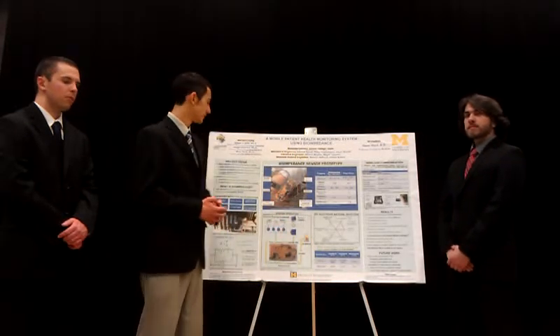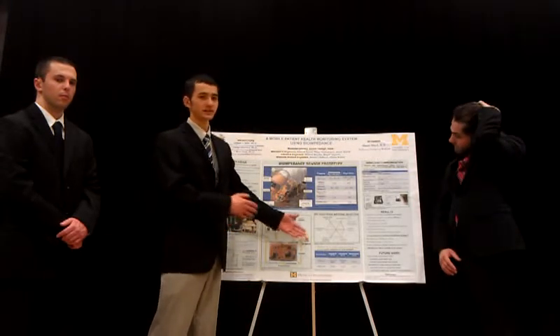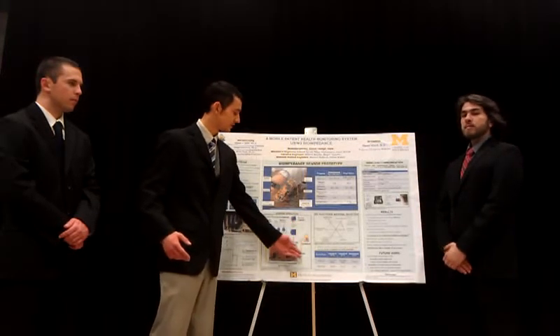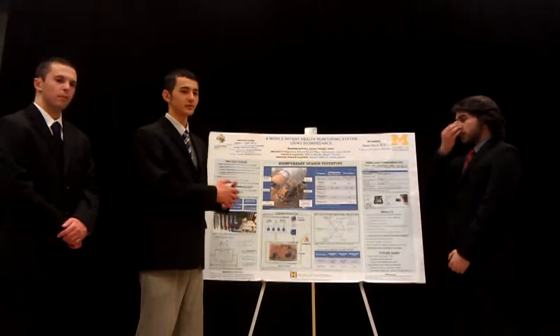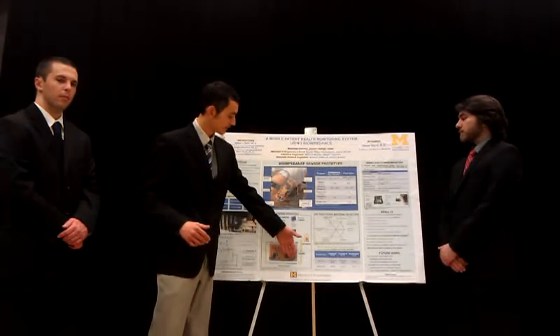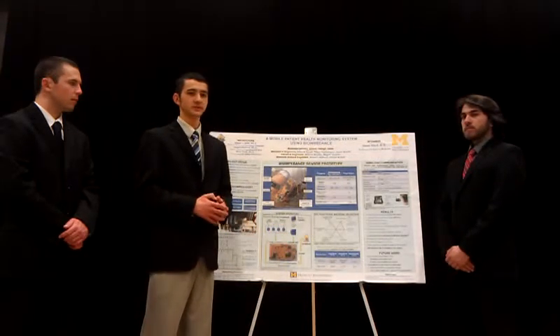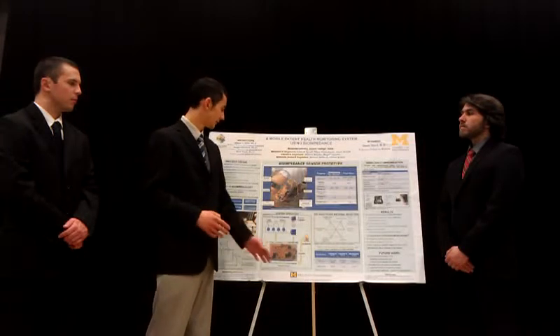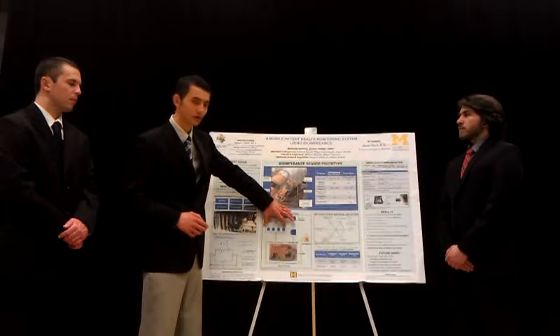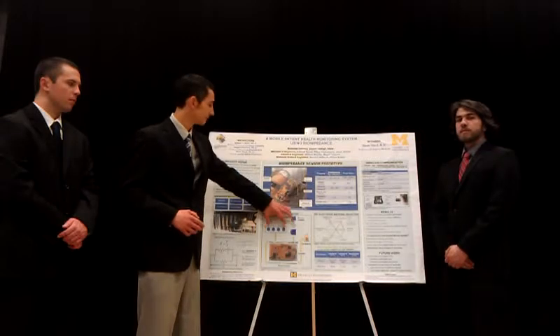This figure shows the system operation. As Jason mentioned, we need alternating current, but it's also supposed to be mobile. So we use batteries and an oscillator that converts the direct voltage of the battery into alternating voltage. Then a current source converts the alternating voltage into alternating current, which has constant amplitude, and sends the current through these two electrodes on the sides.